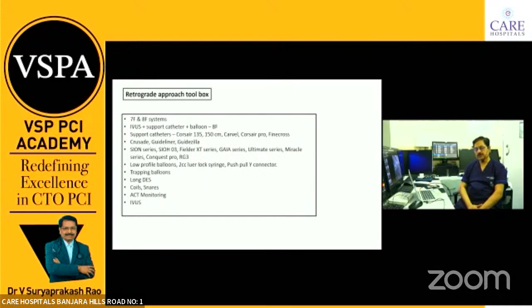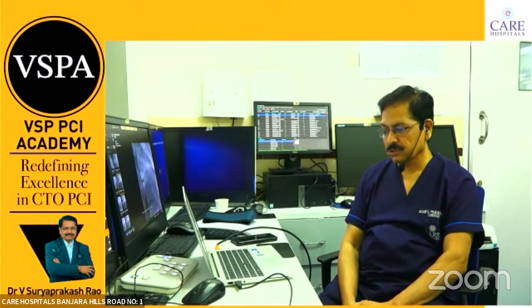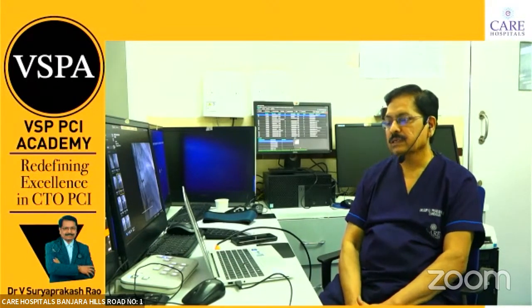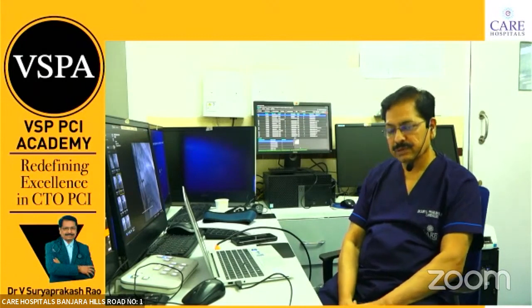So, what you should have in your cath lab. First you try antegrade simple cases like a proximal or mid RCA CTO, or a mid LAD CTO. Don't try circumflex CTO in the beginning, because circ is always a different ball game. Left main to circumflex angle, even a normal PCI will have many problems, as you know. That's why try the RCA and LAD mid. These are the safer things, and for retrograde, after doing many antegrade CTOs with a proctor, then you can try the retrograde. Retrograde should have good 7 French and 8 French systems.